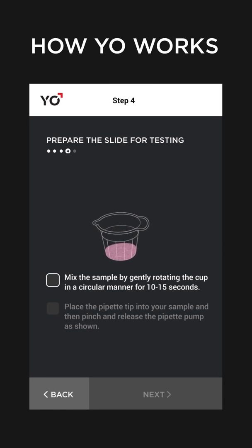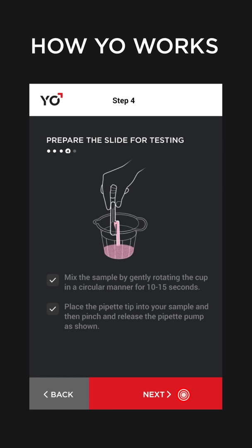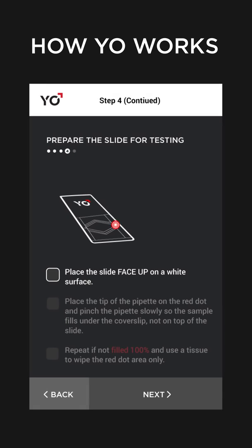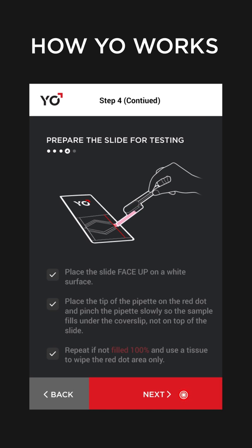Next, mix your sample. Then grab some of it into the little pipette as shown. You now need to fill the YO slide with your sample. Find the red dot on the slide and put the tip of the pipette on it. Pinch the pipette slowly and watch as your sample fills the slide's triangular well.